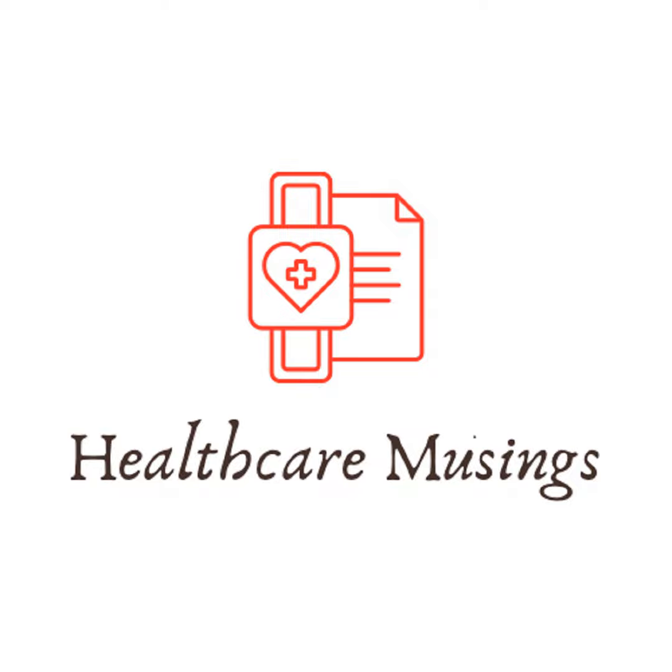Synchronized intermittent mandatory ventilation is a kind of a hybrid between spontaneous breathing and mandatory breathing. So on a SIMV mode, you dial in the respiratory rate, you dial in the tidal volume, you dial in the PEEP, which is positive end expiratory pressure. You also dial in a pressure support, and you dial in an FiO2. Okay, so for example, let's say we do 15 at 450, so respiratory rate of 15, 450, PEEP of +5, pressure support of 10, FiO2 of 50%.